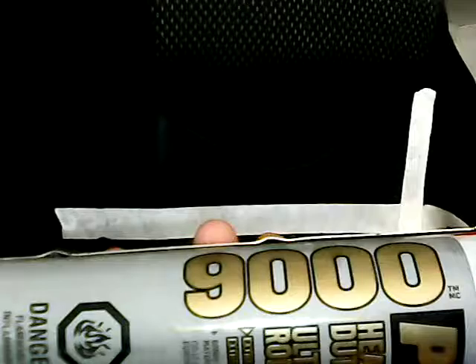Hello, I'm making this video to show how I'm adhering an LED flashlight onto my wheelchair. The adhesive I'm using is made for construction. It's called PL 9000, and this is a very robust and strong adhesive. The only thing you have to check is if the plastic housing the flashlight is made out of contains a few ingredients that this is not designed to handle.